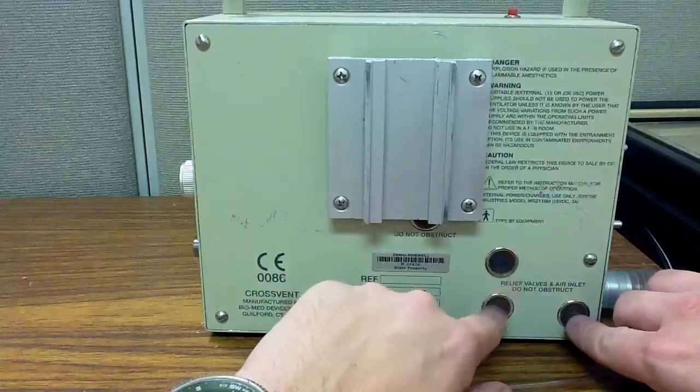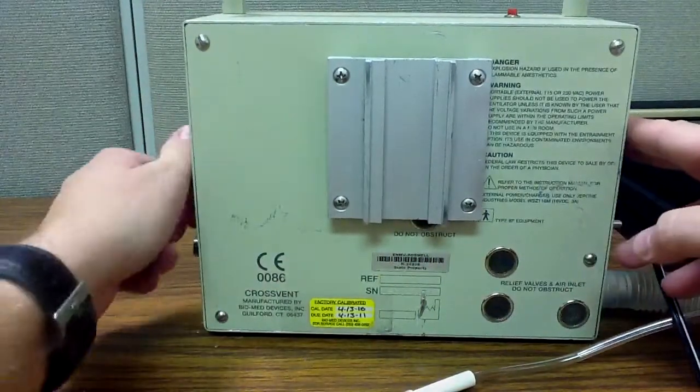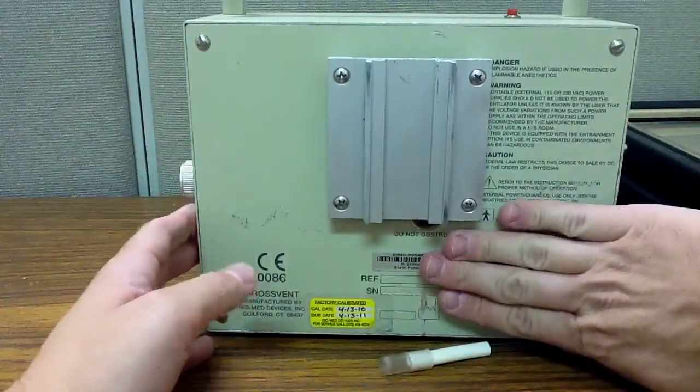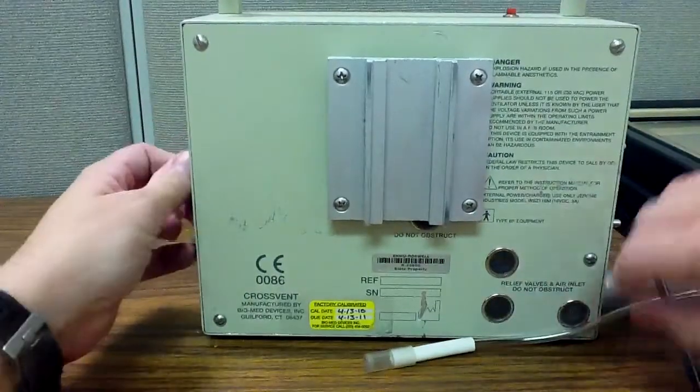And these are air inlet valves as well for entraining air when I have the air entrainment turned on. You don't want to block those, otherwise you can cause problems with FiO2 delivery.